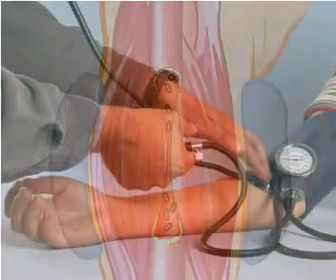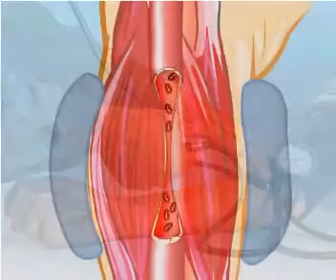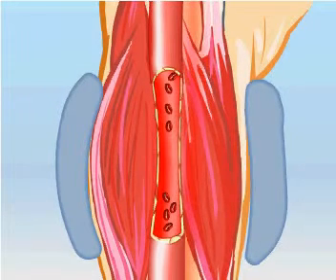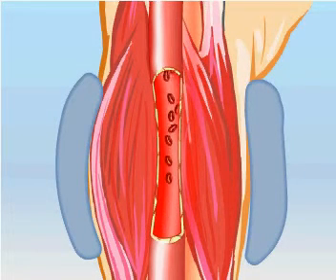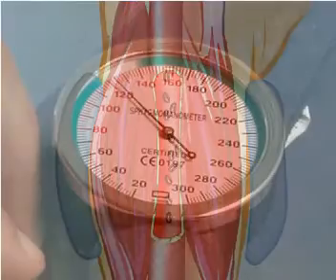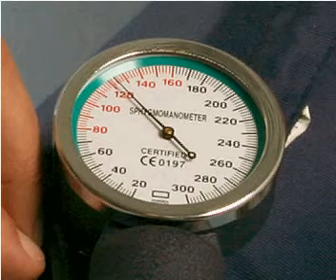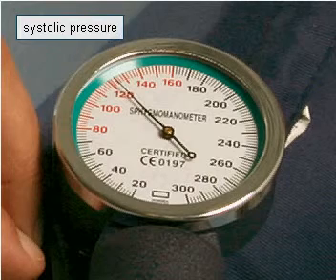Then, the air is gradually pushed away to the first beat of the pulse in the stethoscope. At this point, the pressure of blood driven by heart systoles is equal to the pressure within the cuff, and the first portion of blood comes through the gripped artery. It is heard as the tone of the pulse under the stethoscope. This is the systolic pressure.